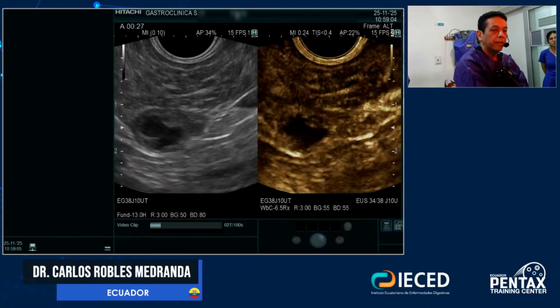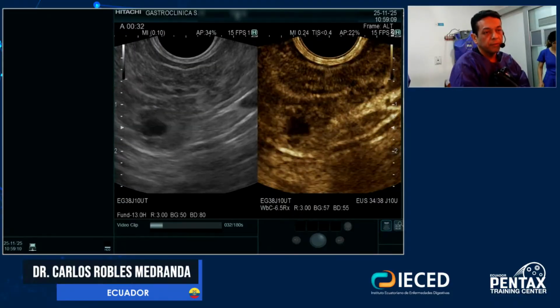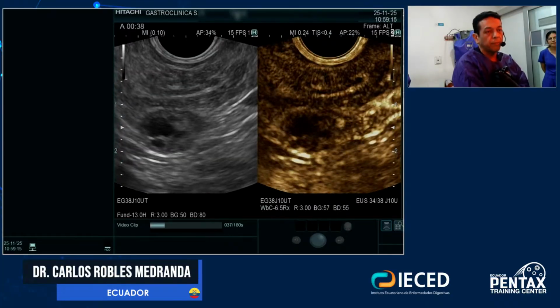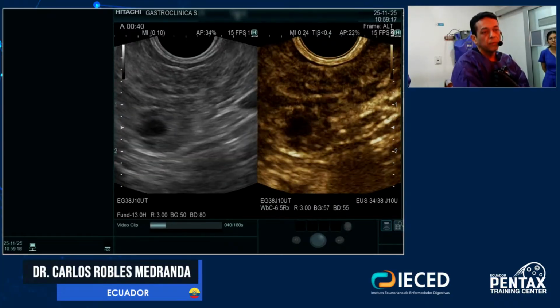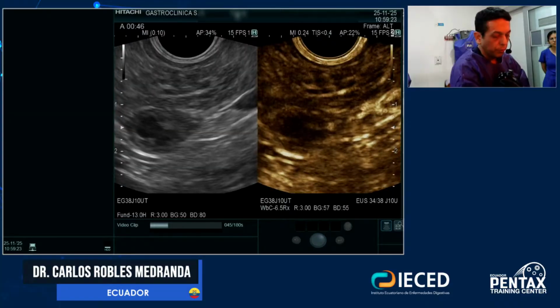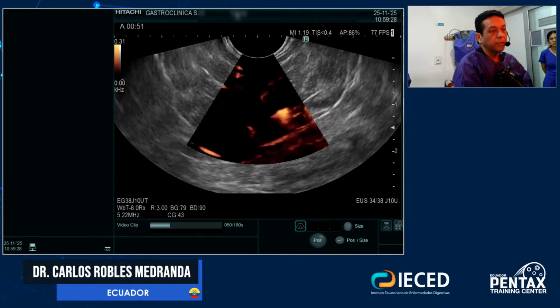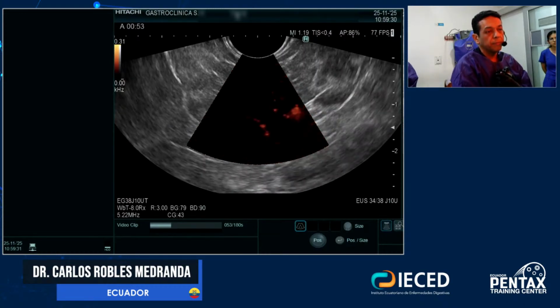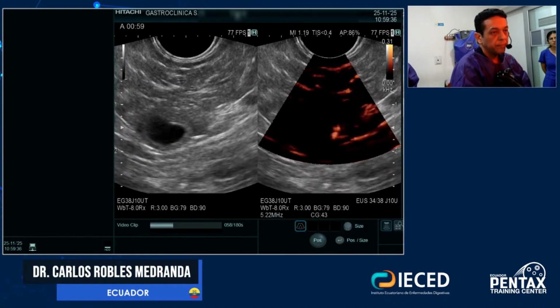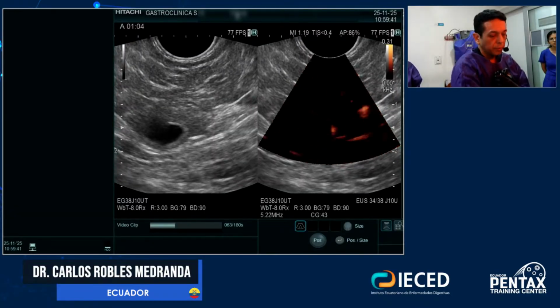I believe the quality of the image from the DFI is a little bit better, you see? More captation. See the wall? And I will show you something nice today. When you use DFI, it will increase a little bit, you see? Very similar. Very good image.